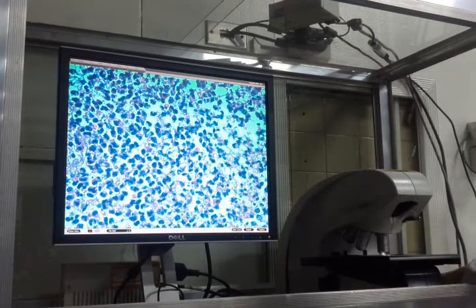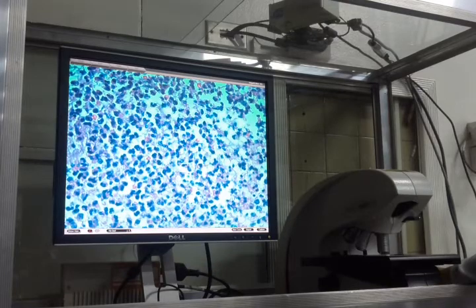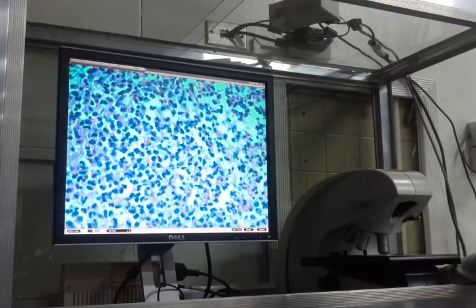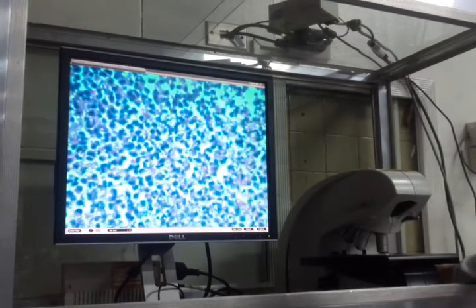This is liquefactive necrosis. What you're seeing are neutrophils, RBCs, and the pink powdery stuff. That's necrotic debris. So that is liquefaction necrosis: no architecture, too many neutrophils, possibly with blood and necrotic debris. The rotten cells are being eaten by the neutrophils. In other words, you have a pocket of pus in this area here.